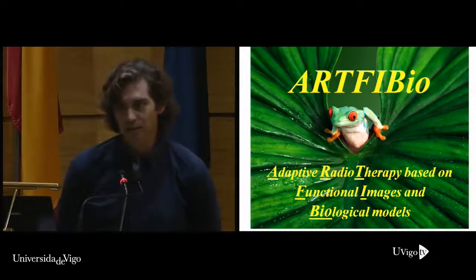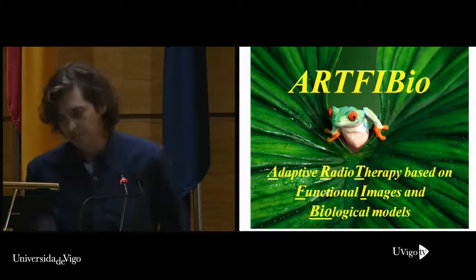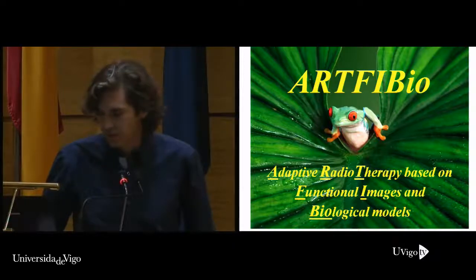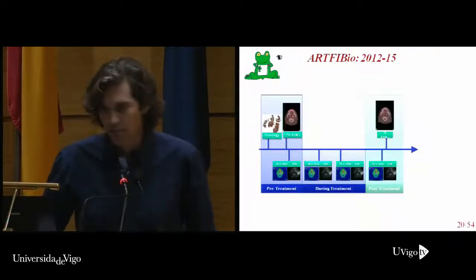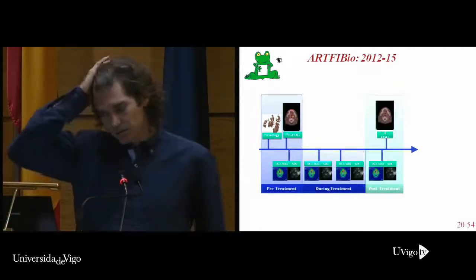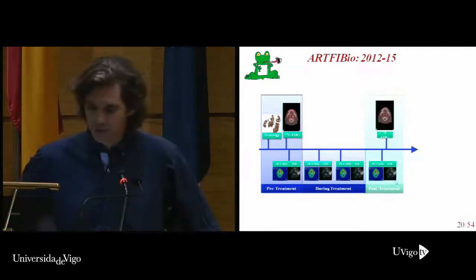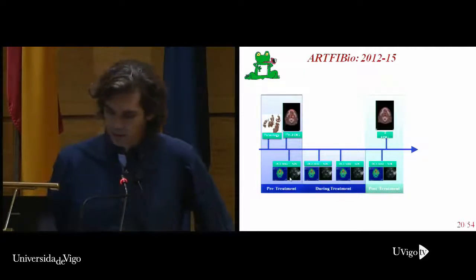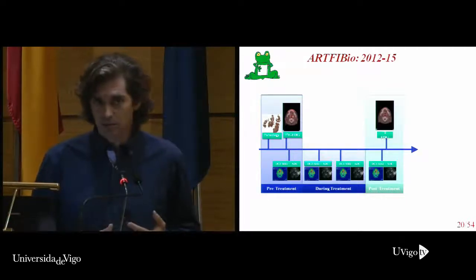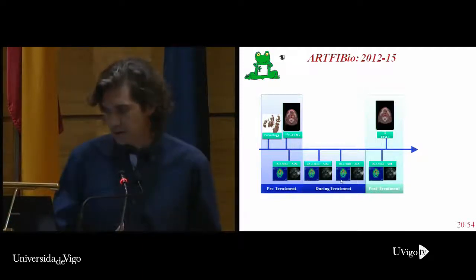Now I would like you to take a glance inside our project, Artifibio. Artifibio is the acronym of Adaptive Radiotherapy based on functional image and biological models. We start collecting information from pathology and FDG previous to a treatment, and two studies: the full study of MRI, T1, T2, diffusion weighted ADC, and dynamic contrast enhanced.